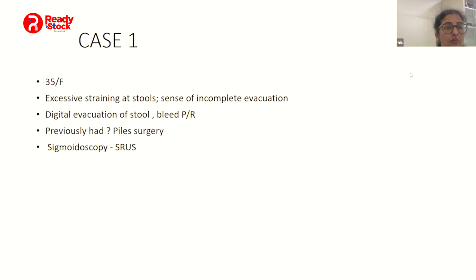If the patient is doing balloon expulsion, but he is not able to perform, that is rectoanal incoordination is present. So in that case, normal expulsion with rectoanal incoordination is present. That is what, ma'am. The thing is, this is what I'm saying.